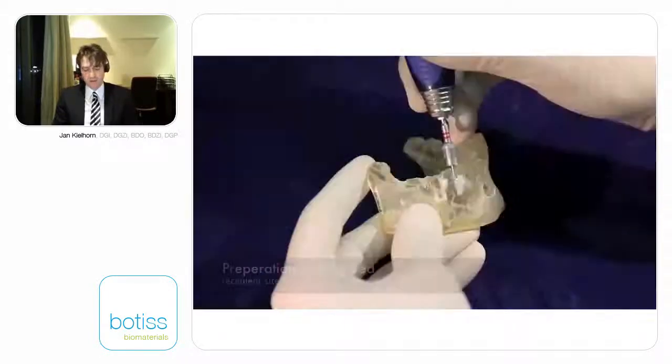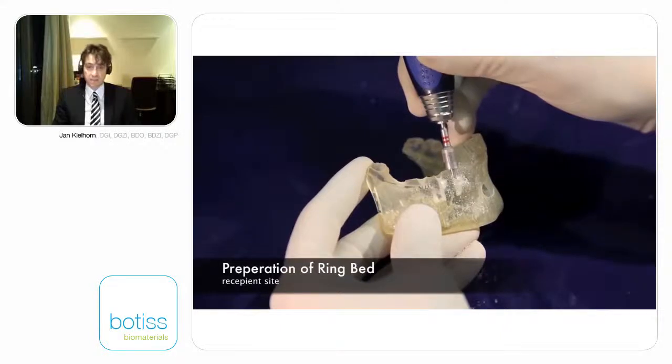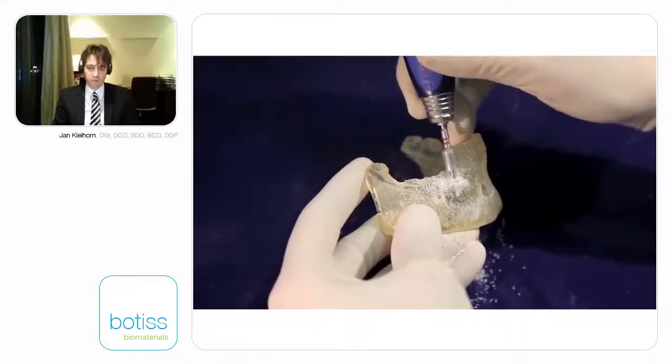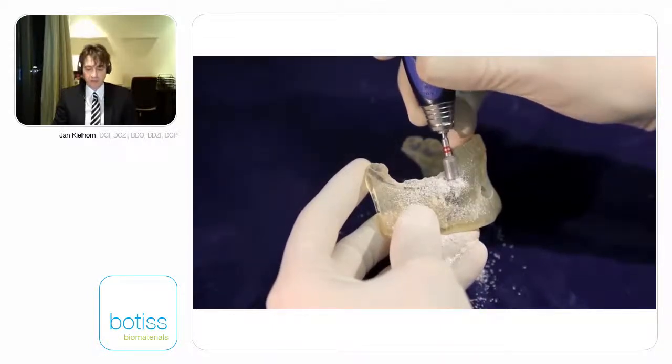Also, the benefit of this system is that the rings will be held in place for the final drill by the template, so you don't have to hold the drill with a forceps or with your fingers or some kind of instrument.